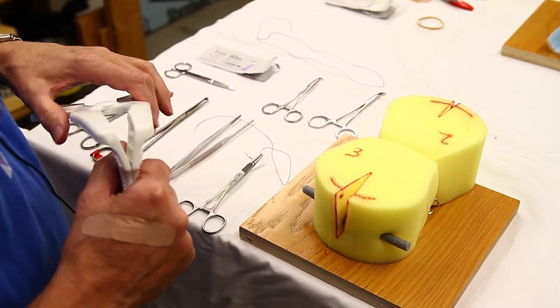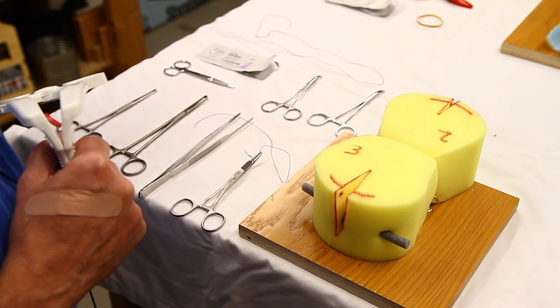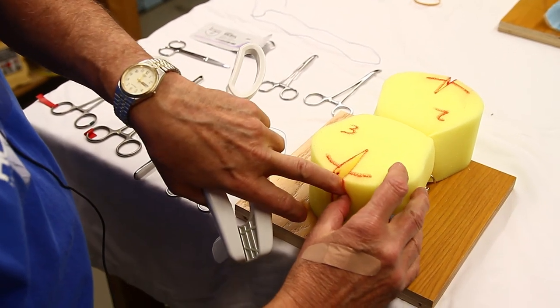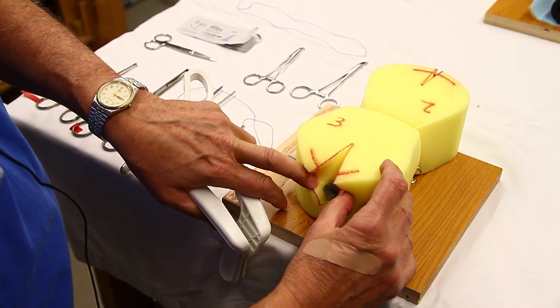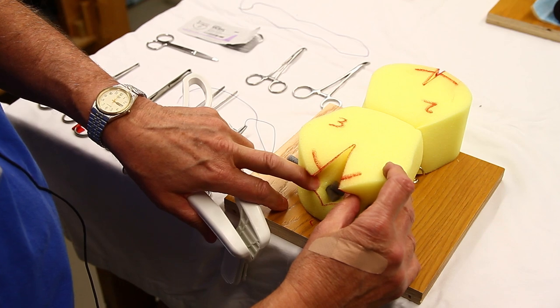Visualization is important here. A Galpy retractor, which unfortunately I don't have for this video, but I did show you a photo of, is very helpful.